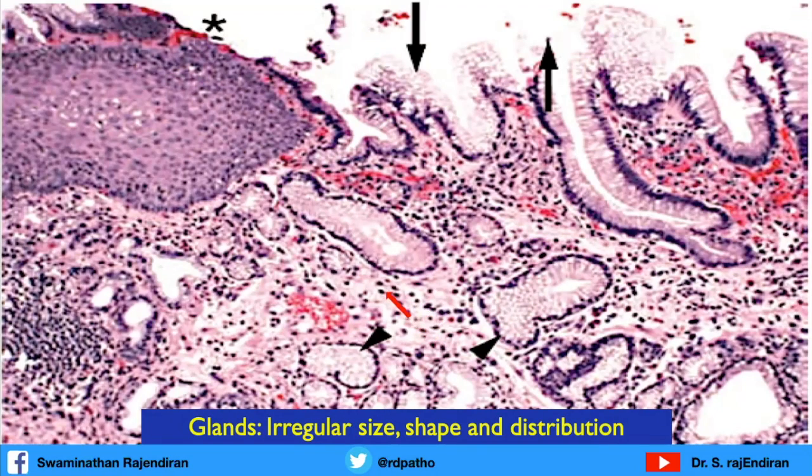Please remember, the presence of lymphocytes and plasma cells is not a feature of chronicity, but architectural change by way of irregularly sized, shaped, and distributed glands is an indication of chronicity, the criterion for chronicity.